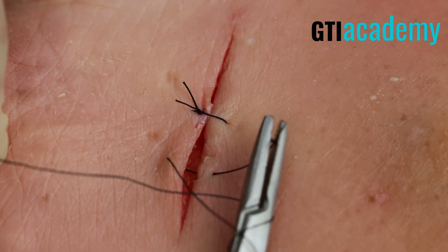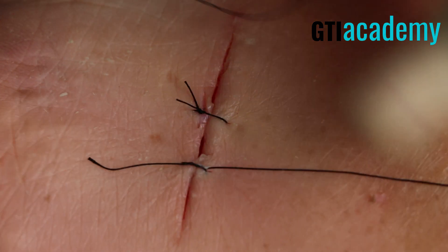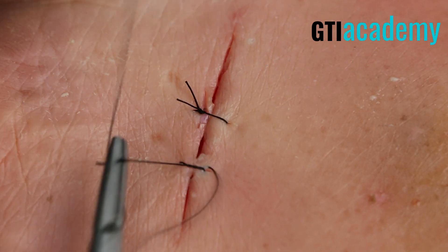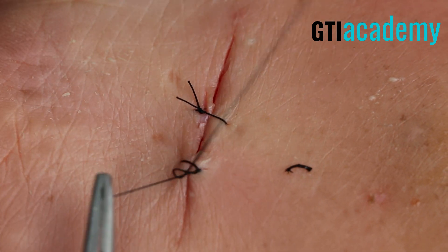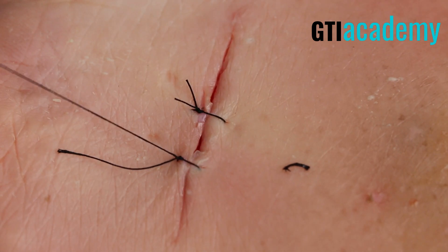Complete the circle. Wrap the suture twice around the needle driver. Notice it's flat. Then once and a third time.